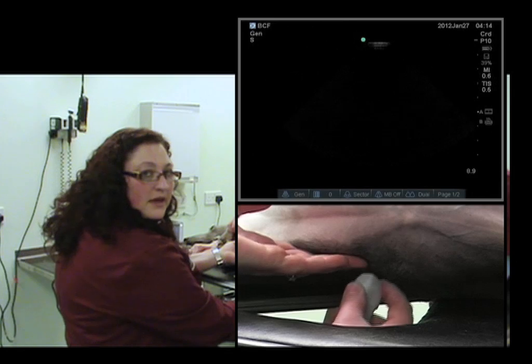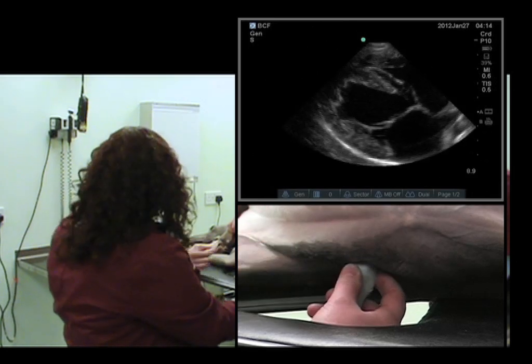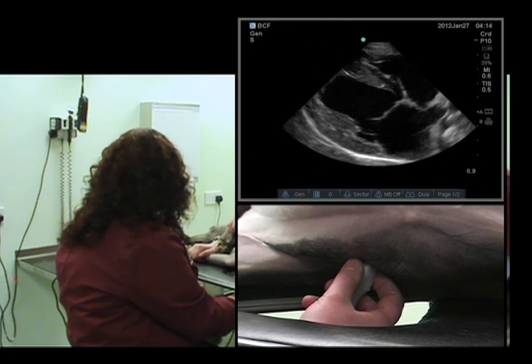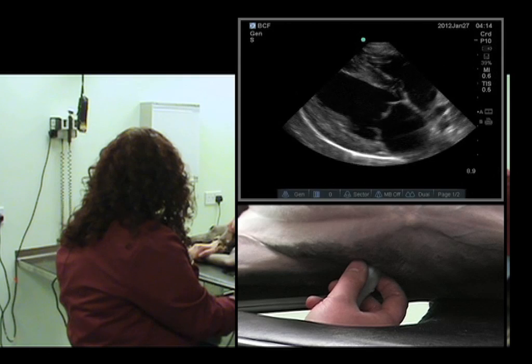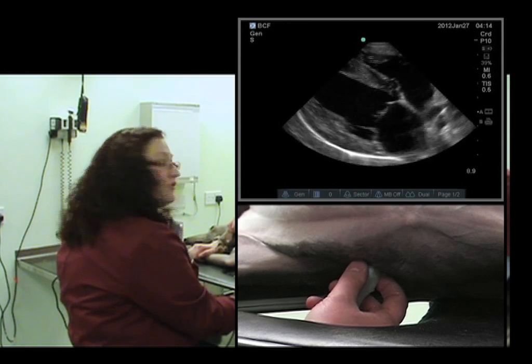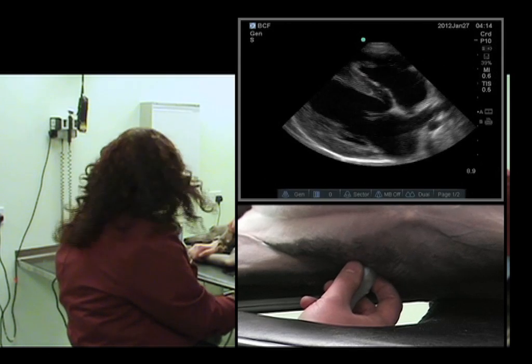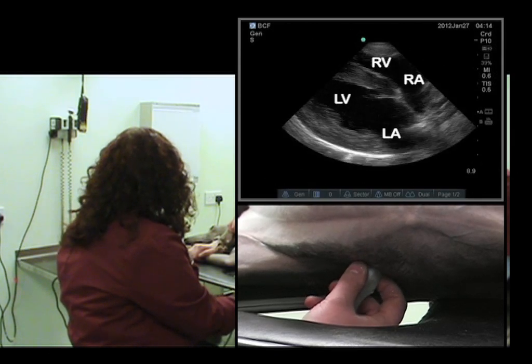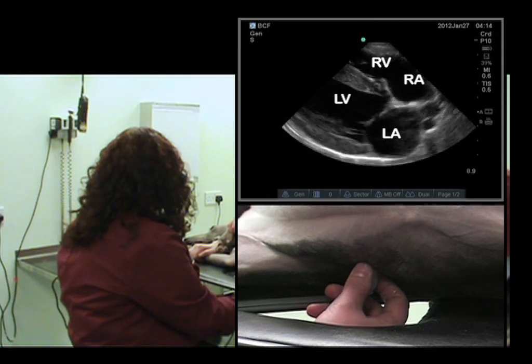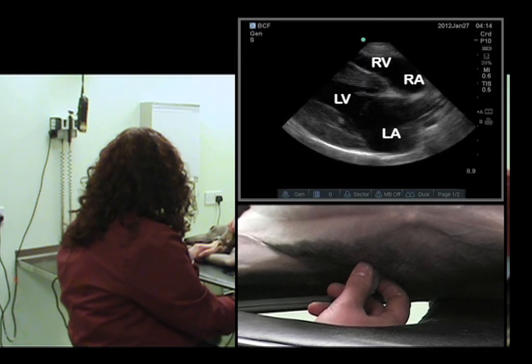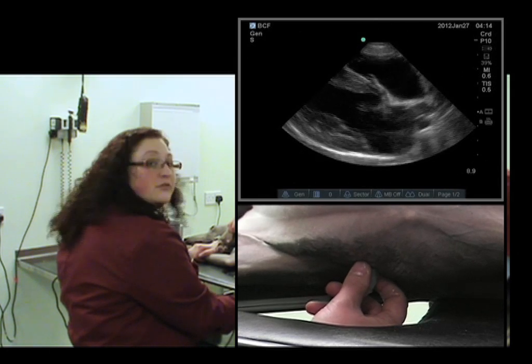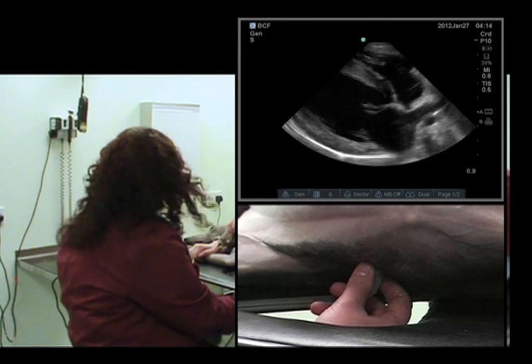Feel for the apex beat, place in the intercostal space, we'll just optimize this view, and now we'll start to rotate anti-clockwise.